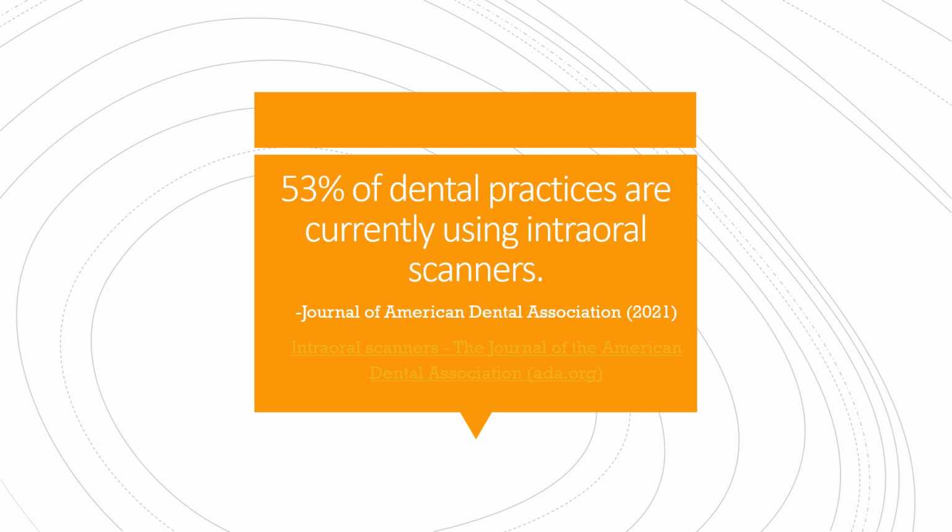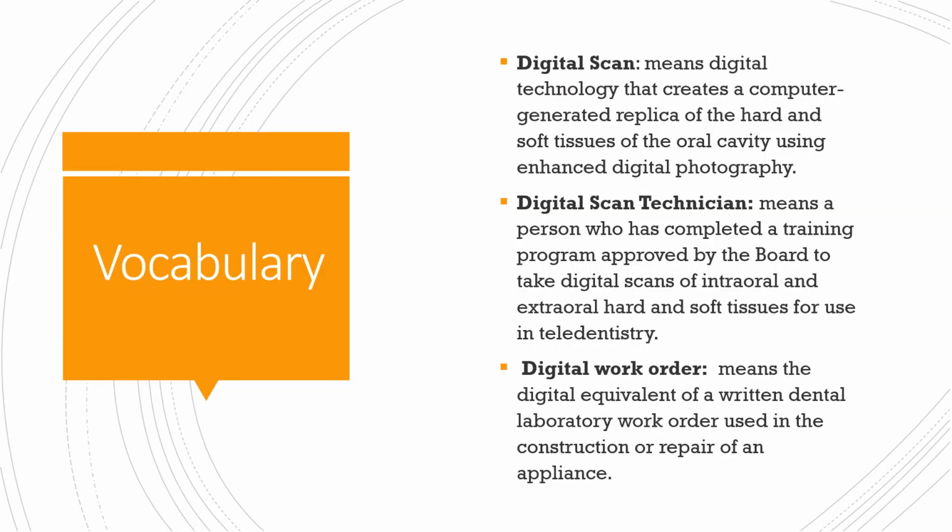So it's important to learn about the basics of digital impressions or intraoral scanning, because chances are you're going to encounter it once you go into private practices, because they are being utilized more and more as opposed to your traditional impressions. All right, so let's talk about the vocabulary.